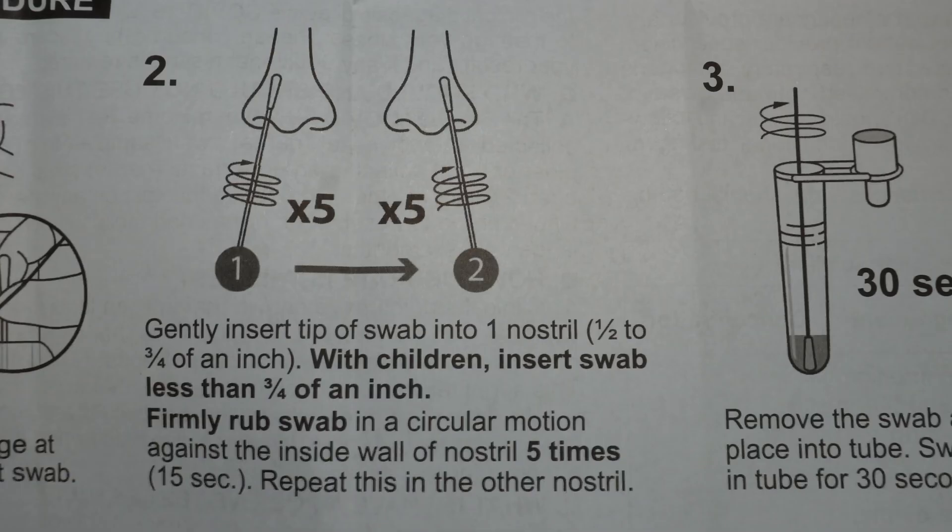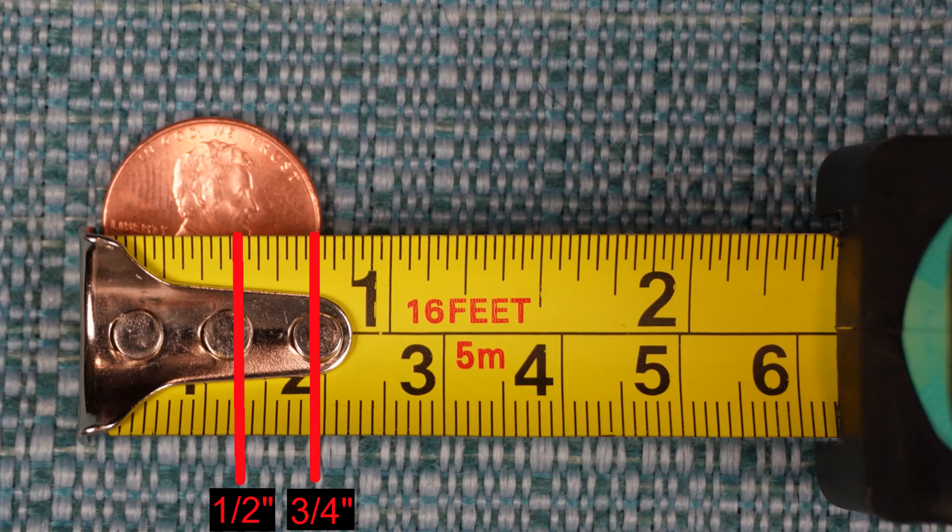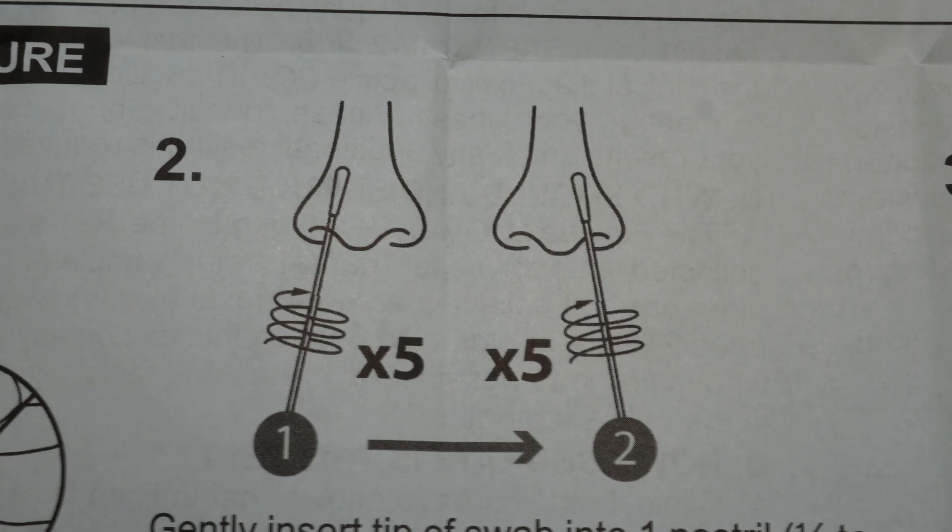It also says to go one half to three-fourths of an inch into your nose if you're an adult. Three-fourths is about the size of a penny, so do not go further than the size of a penny into your nose. For children, it says to go less than three-fourths of an inch.